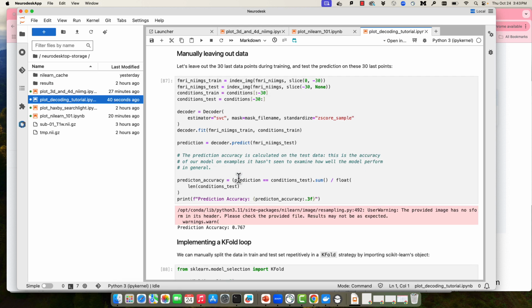Within this example notebook they're giving you, they're restricting a lot of their analyses to be pretty simple, just to save computation time. So we're usually not just interested in just 2 labels. Usually it's more than that. And also we're restricting it to a pretty small area as well. And that's what all of these different numbers mean.